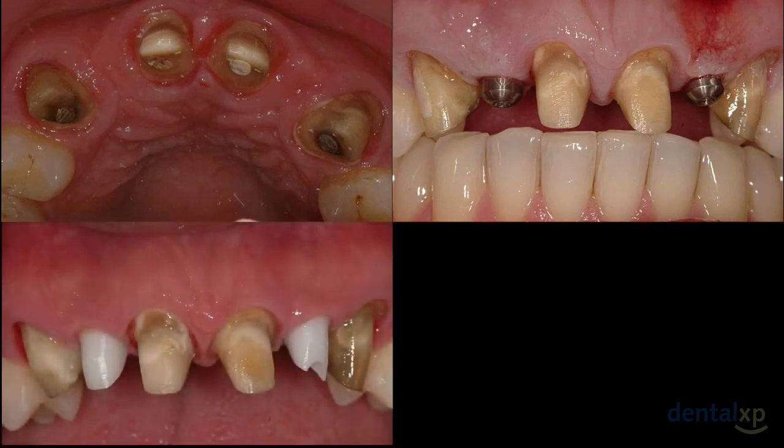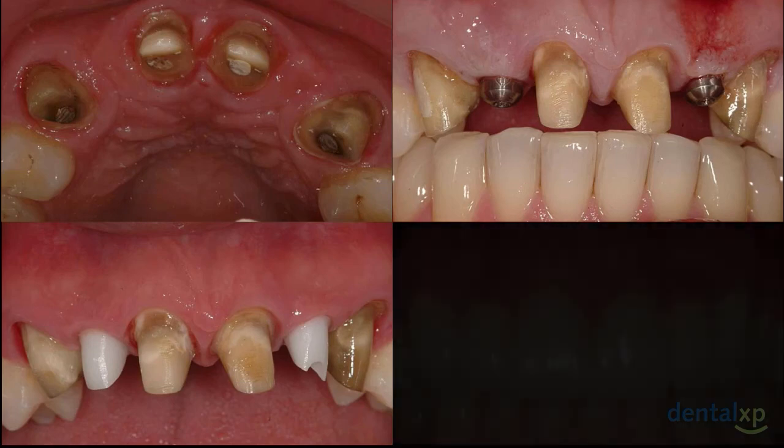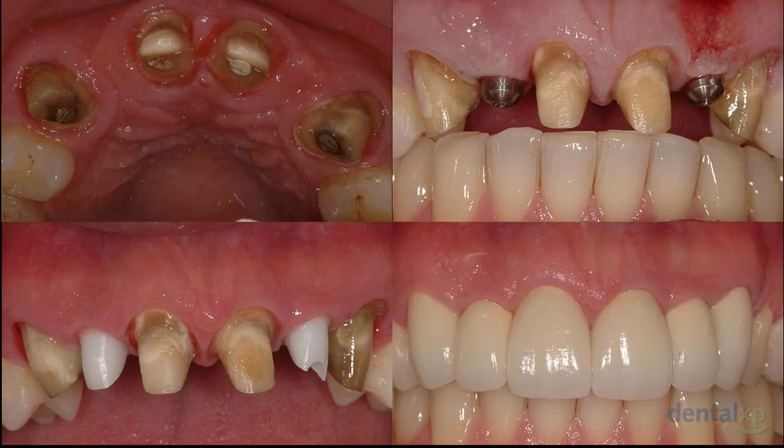Once the implants were placed, traditional healing was used and custom abutments were used for the implants with the restorative prostheses or crowns cemented in place, taking the patient before and after.